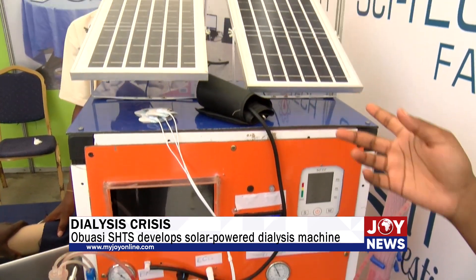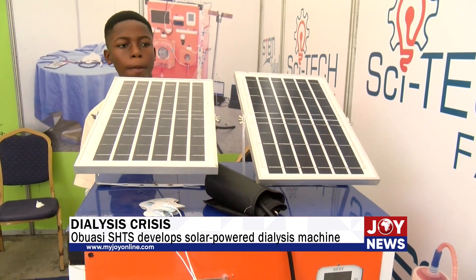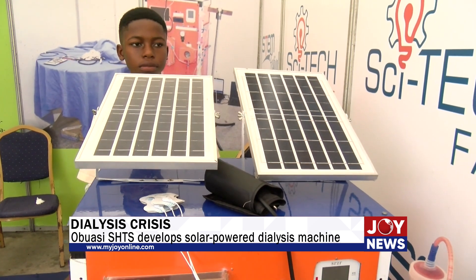We have the solar panels — we got those too. So our device operates on solar power, so in case there are power outages, the system can still run.